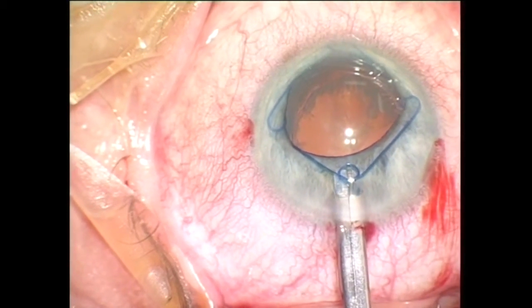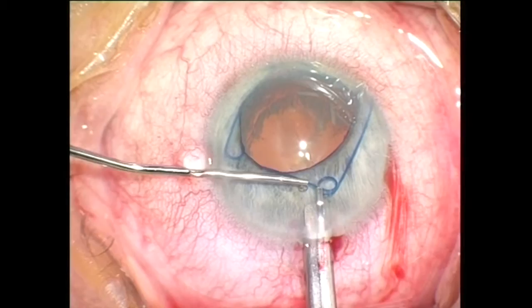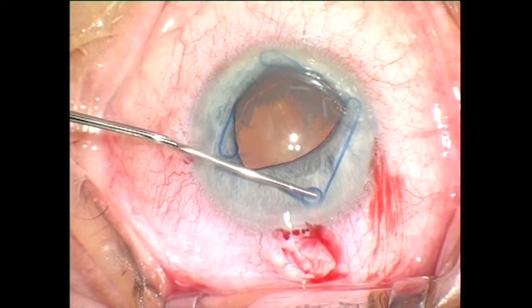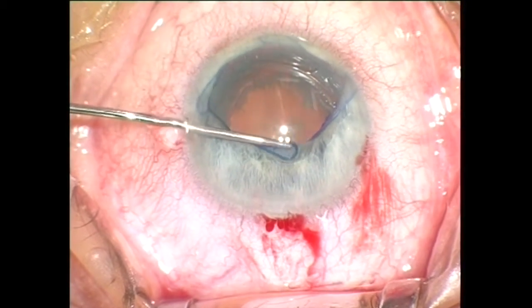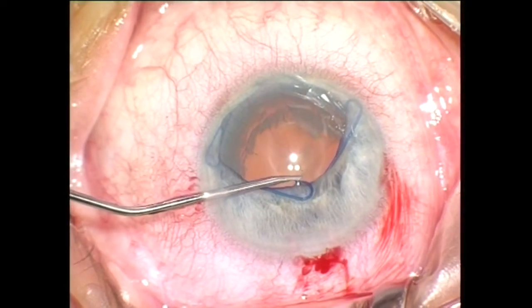After both lateral scrolls are in place, I'm using a manipulator introduced through the side port to release the proximal scroll from the injector hook and to position it in place. The scroll is released from the instrument with a rotational movement.